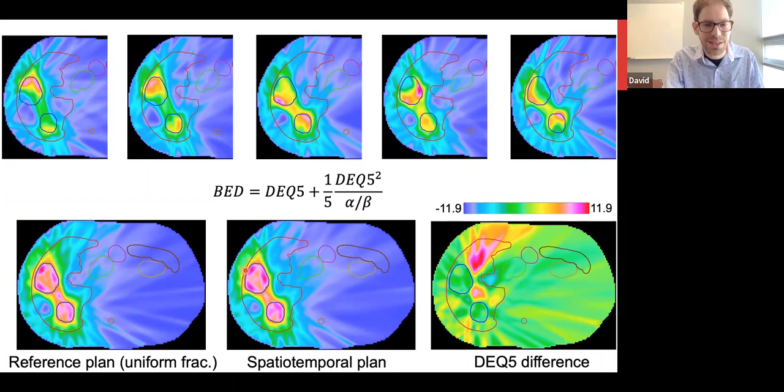And now, because these are both in the physical dose space, they are both on the exact same scale, so they are directly comparable. So when you see that over here in the healthy liver, there is a medium dose, greenish, yellowish, whereas here it's all blue, it's much colder, that's an explicitly interpretable difference. You can literally take the difference and see that indeed the 2 doses have basically the same effect on the targets, equivalent to delivering the same doses in 5 fractions in both lesions, but there is substantial liver sparing, right? And even the scale, the numbers are interpretable, right?